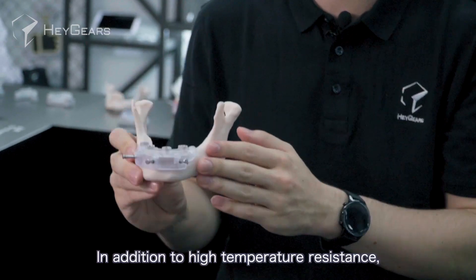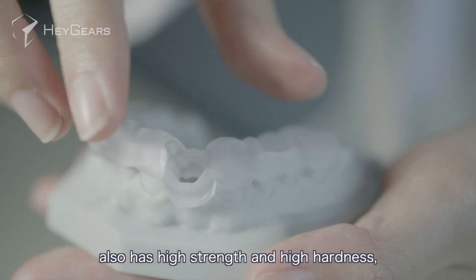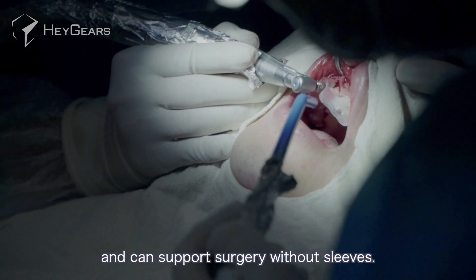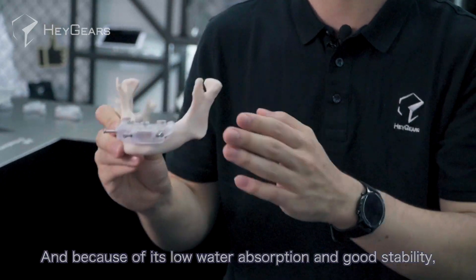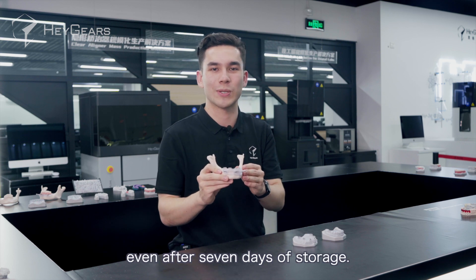In addition to high temperature resistance, this implant guide material also has high strength and high hardness, and can support surgery without sleeves. And because of its low water absorption and good stability, it can ensure that there is no deformation or yellowing even after seven days of storage.